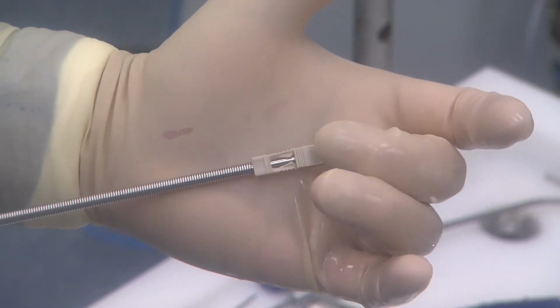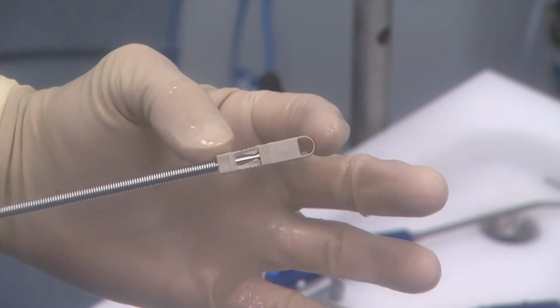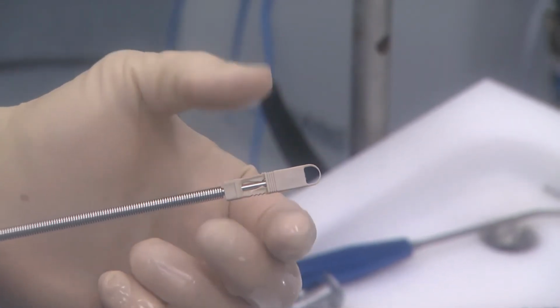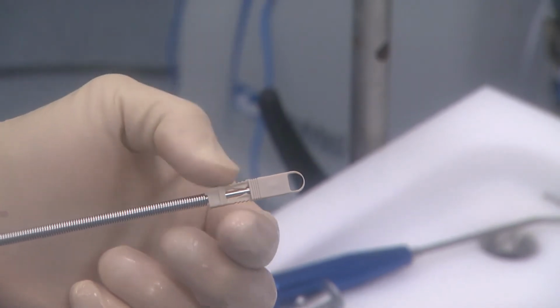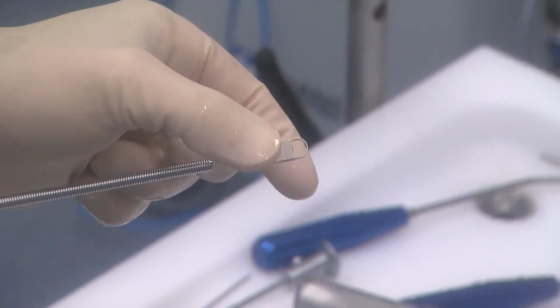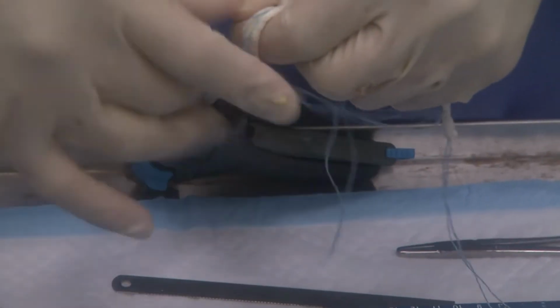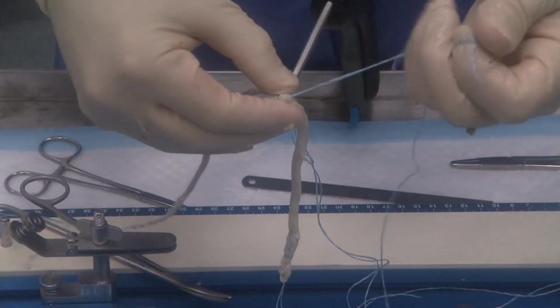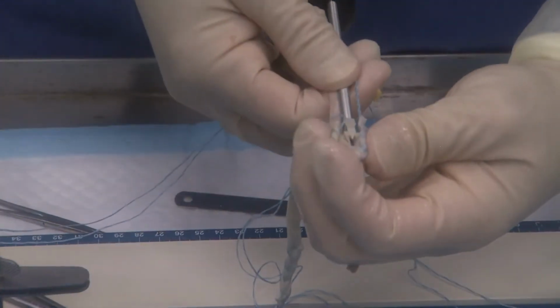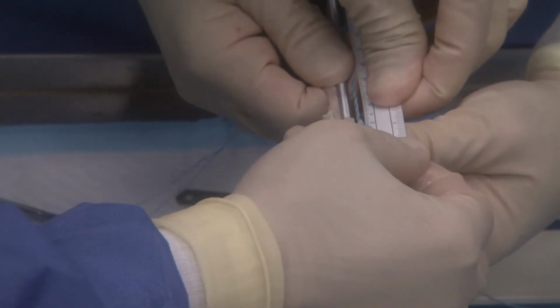Our graft is going to go through this hole right here, and then when this deploys, this whole mechanism contracts, and these two wings spread out this way against the tunnel, and then the block lock wings spread out against the tendon and lock the tendon against the tunnel. And I want to pass one end in one direction, and then I want to pass the other in the opposite direction. And then I want to cleat this construct so that the tails, the shorter tails, are about 30 millimeters.